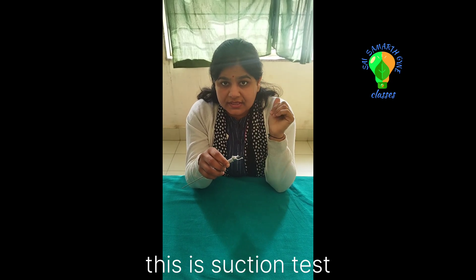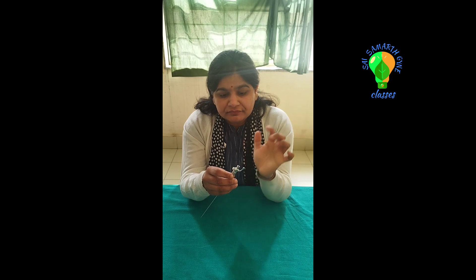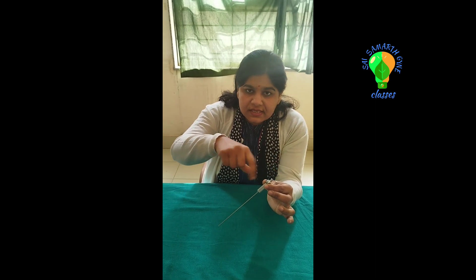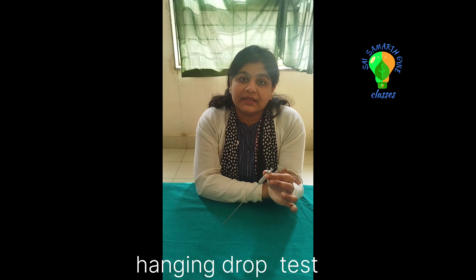The third test is the hanging drop test. Place one drop of saline on the hub of the needle. When you lift the skin — lift the abdomen — that drop will be sucked inside. If the drop is sucked in, you are confirmed to be in the peritoneal cavity.